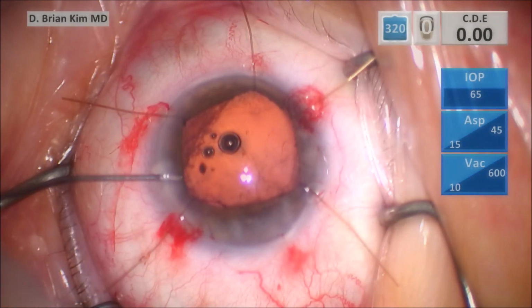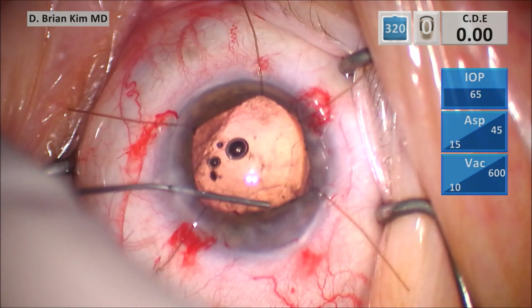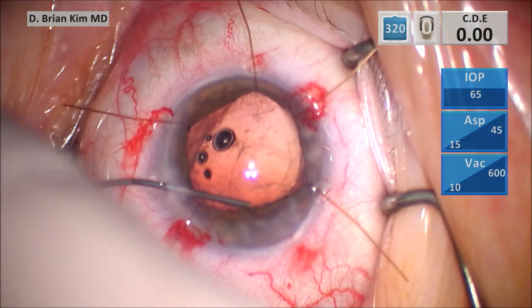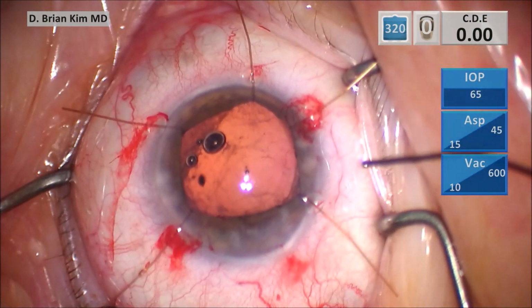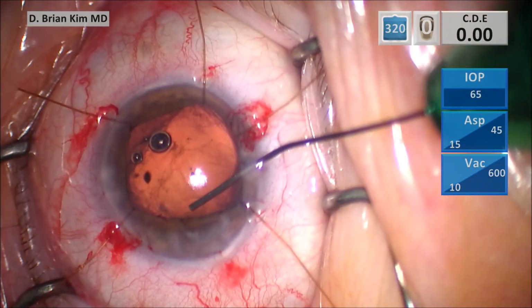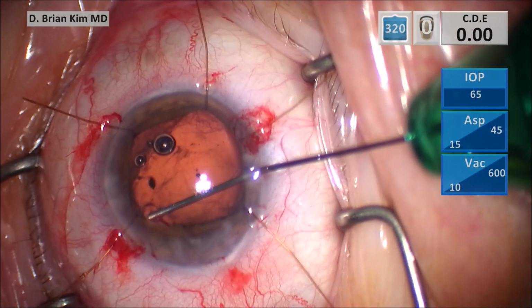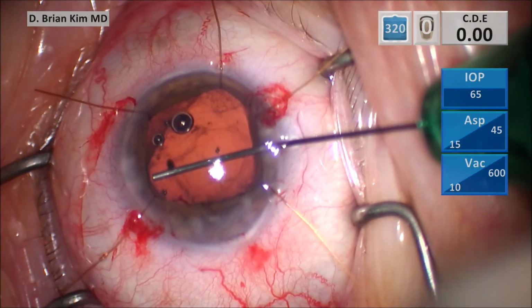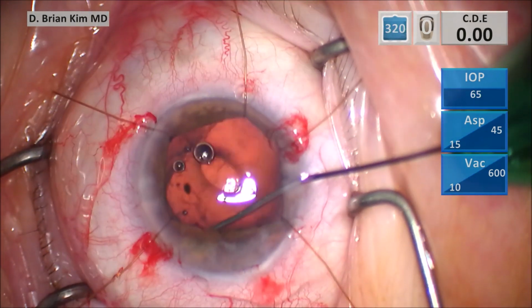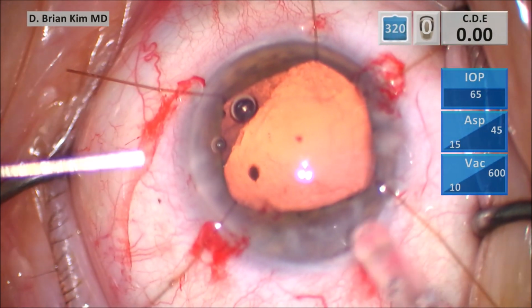And as I'm going around, I'm pushing cohesive viscoelastic and trying to visco-separate the anterior and posterior capsules all the way, hopefully towards the capsule fornix. Again, all around except for where the anterior capsule tear is. And so you can see I'm spending a lot of time very carefully trying to separate the anterior and posterior capsules so I can get this lens, a single piece acrylic lens, within the bag.